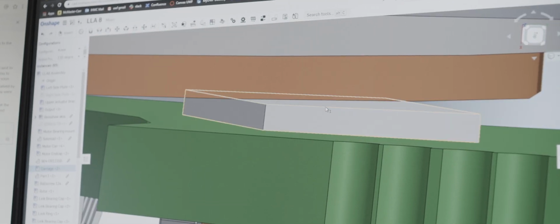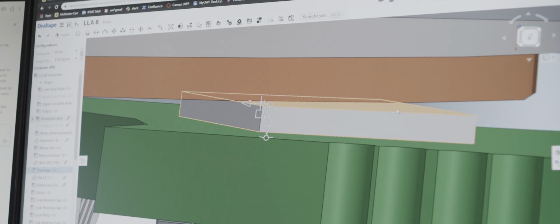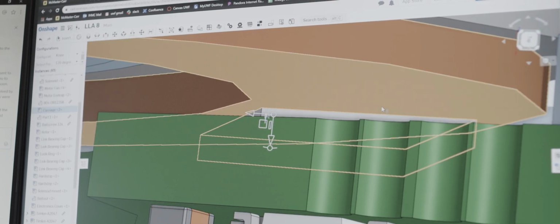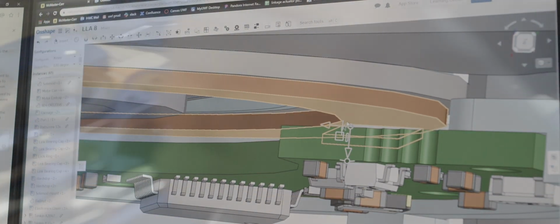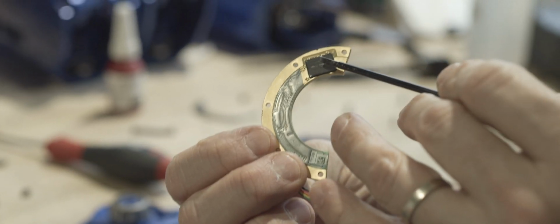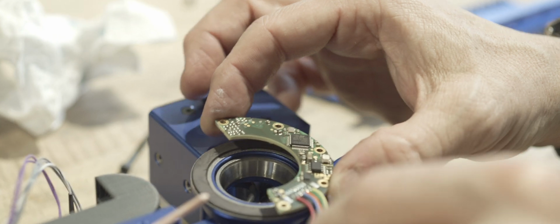And in the drawing here, you can see the read head and the specified gap. It should be about .35 millimeters. This is the read head for the encoder and it sits off of right around here, some rotation.